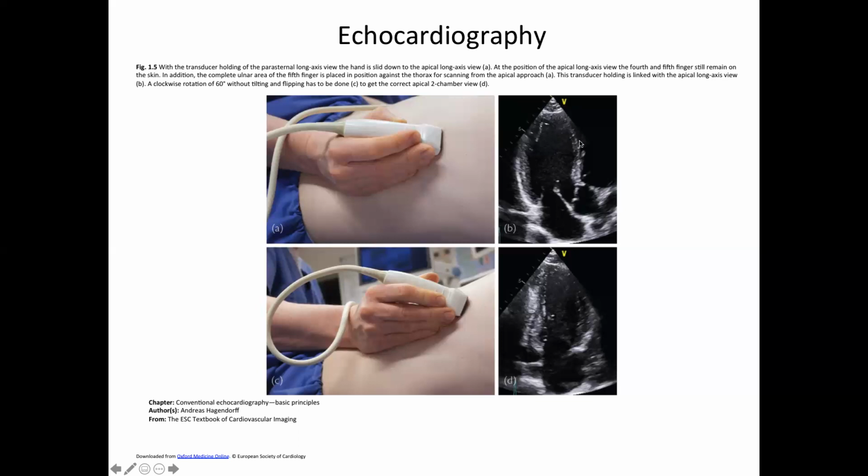You can see a couple of immediate things just from looking at these two pictures. The spatial resolution of the picture up here, these little dots and things like that in this dimension, look pretty sharp, but then as we go farther away from the transducer, everything looks like it's getting blurred in this dimension, right? Which is the case. So the spatial resolution is depth dependent, and we'll see how you adjust the depth of that.